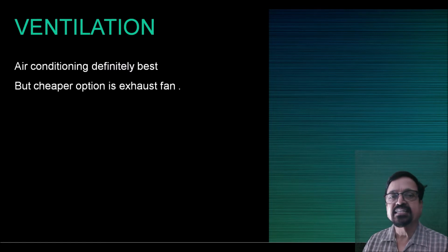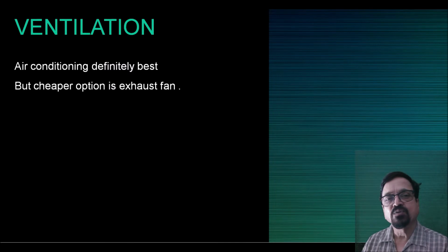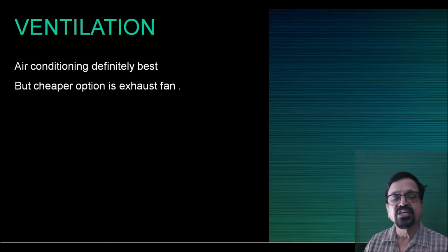So is it that the darkroom should be just something like a packed space on all sides, no ventilation, no windows? No. Good ventilation is required. As I told you, there are certain fumes from the chemicals. There is also high humidity inside, and especially if there is high temperature, to work there for hours together is really tedious. So air conditioning is the best solution.